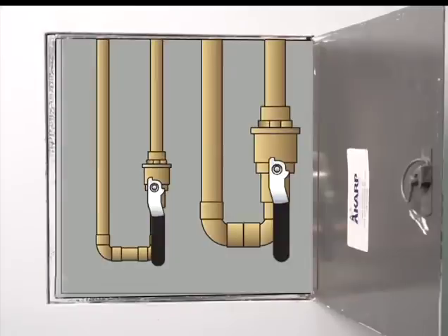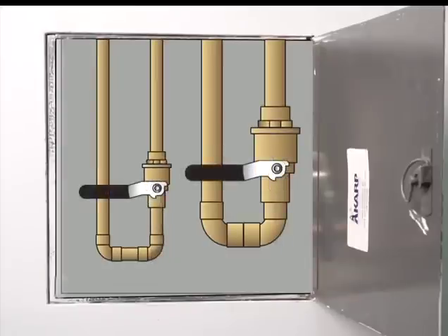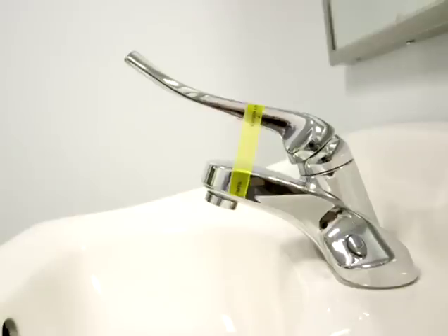Additionally, the collector must secure all internal sources of water and other materials that could be used to adulterate the specimen. For example, as the collector, you will want to secure all faucets and soap dispensers with tamper-evident tape. Procedures for securing collection facilities will be discussed in greater detail later in this section.